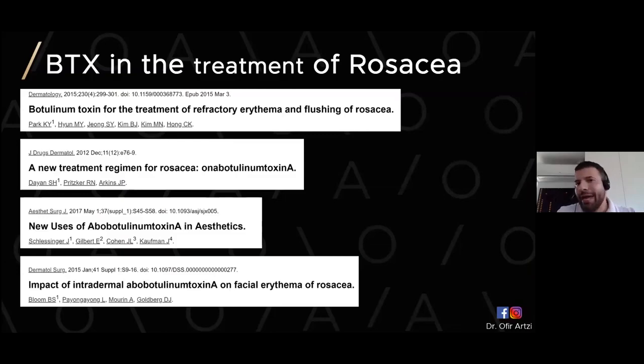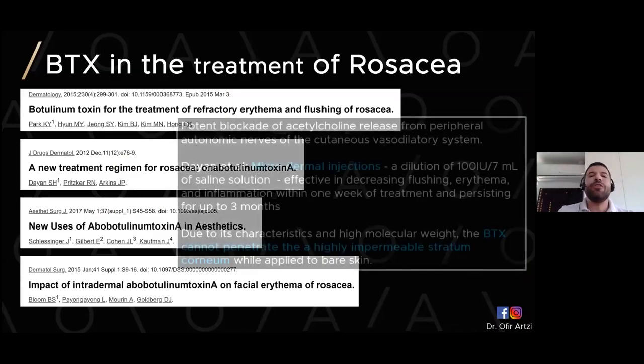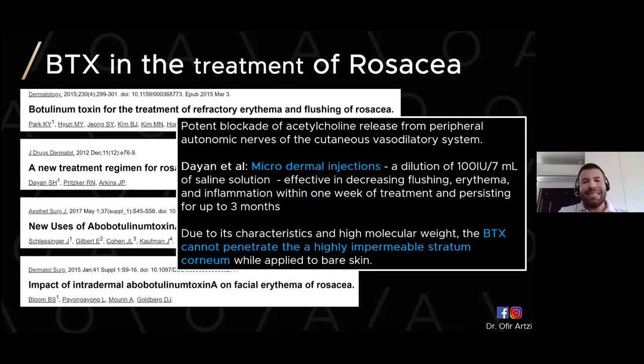She came actually with, I would say, Professor Google and the recommendation of treating rosacea with injection of botulinum toxin. These are the publications that she came with. So I told her we can try injections, and she didn't want to be injected. And then we offered Tixel followed by the topical application of botulinum toxin.